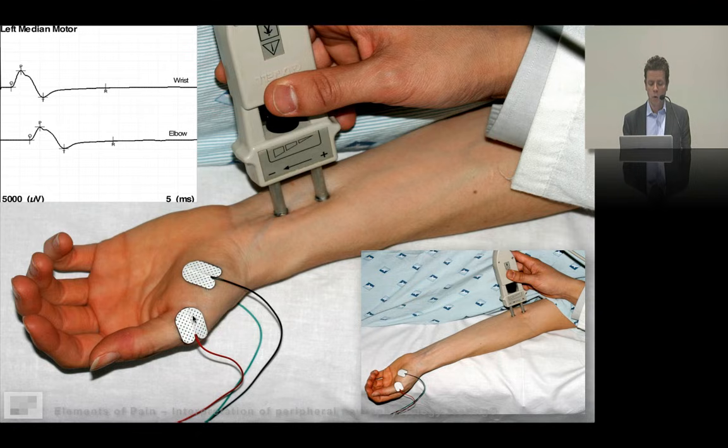We then make direct recordings over the muscle from the thenar eminence, which we'll call abductor pollicis brevis, but it's probably more the median innervated muscles of that group. And we have a reference electrode over a bony prominence and the active electrode over the muscle. And then we stimulate the nerve both at the wrist in a distal sense, and in this situation we do a proximal stimulation at the elbow.